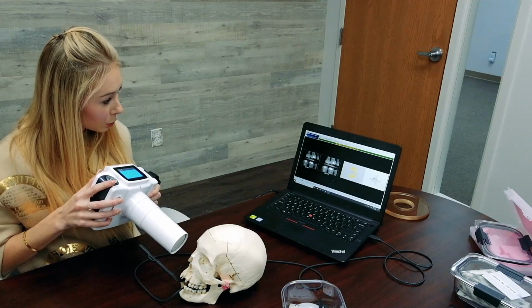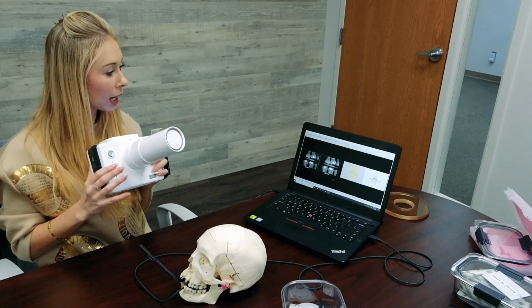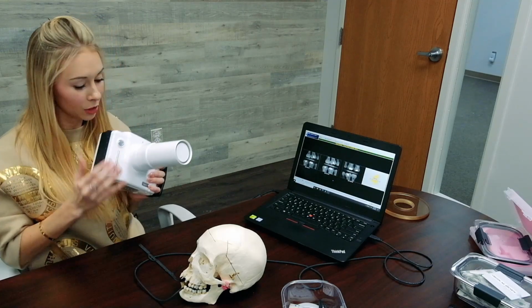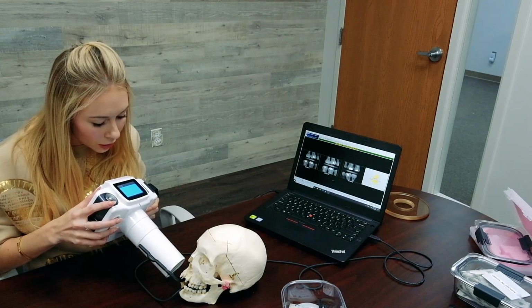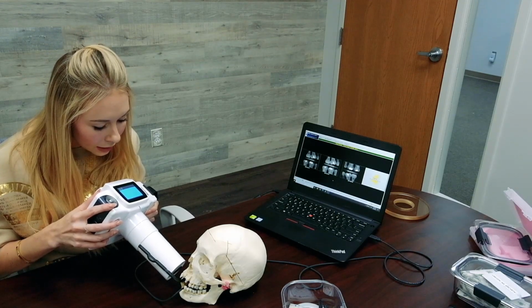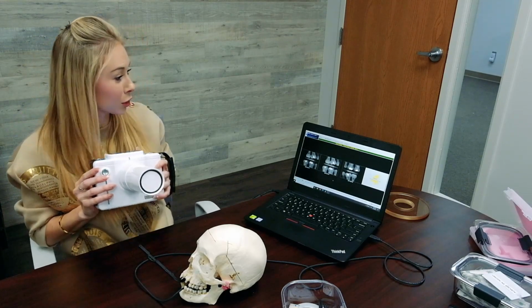What's really great about this, you guys, is if you make sure you're holding this, it's super lightweight and durable with the portable tube head. And just making sure when you're lining up your images on the bar of the sensor tool in the center makes for proper placement. So practice makes perfect, you guys. I cannot say that enough because it is definitely not easy. You professionals make it look easy.